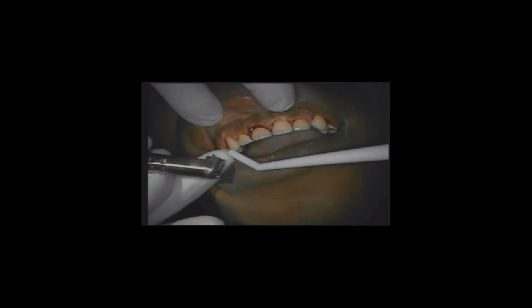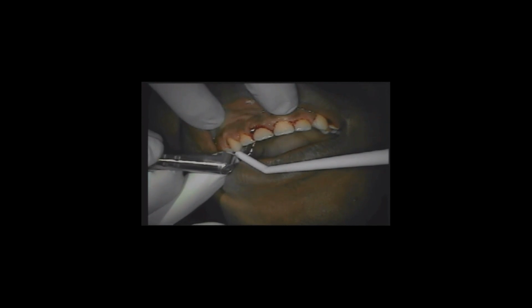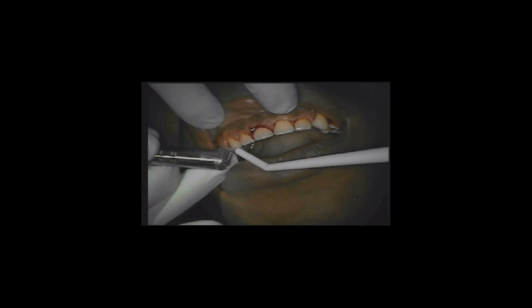So now we're going to finish the tissue with the tipless handpiece and just start working on our final contour and refining that tissue bevel. And our energy setting is going to be about the same. We're not really going to change anything. What we're trying to do at this point is not remove a lot of tissue. We're just refining.